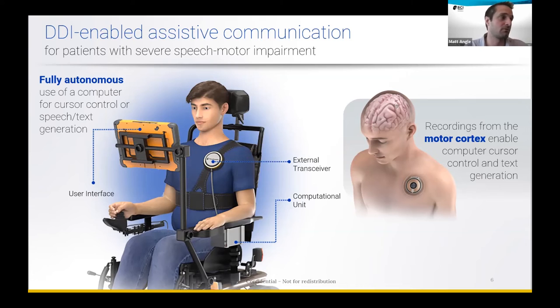What we see based on all of the published work to date is that the one place where our BCI's capabilities have certainly exceeded the bar for being therapeutically useful is in the area of communication. When we look at, for instance, cursor control, but also control of text, especially in the Willett study, we can see that for a patient with tetraplegia, we're now at the point where we can offer very useful interaction with a computer. In my view, it has gone beyond just a proof of concept study, and it's now at the point where we can do very useful things that could even earn reimbursement from CMS in some pretty significant amounts.